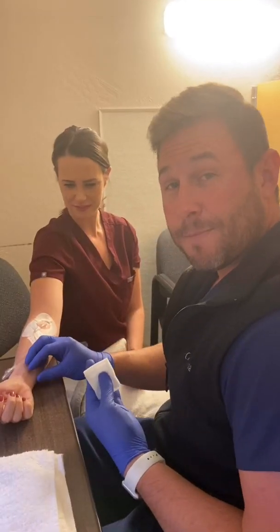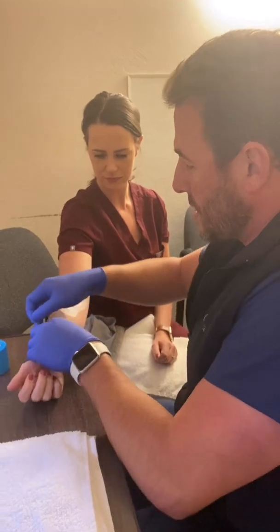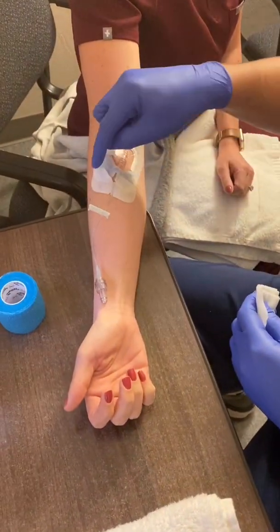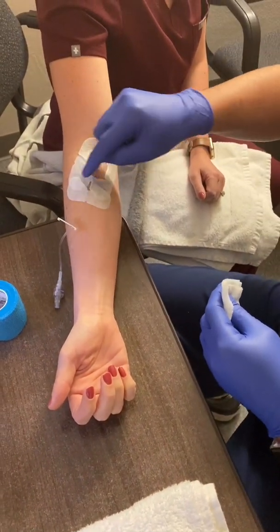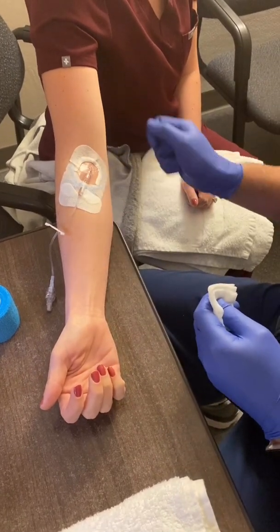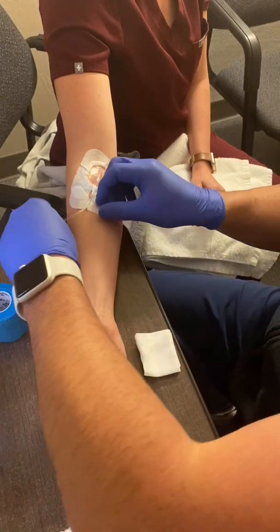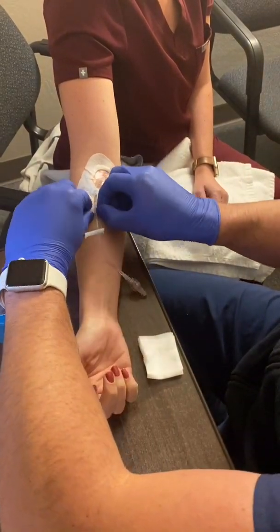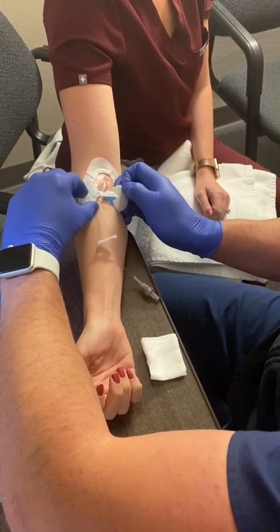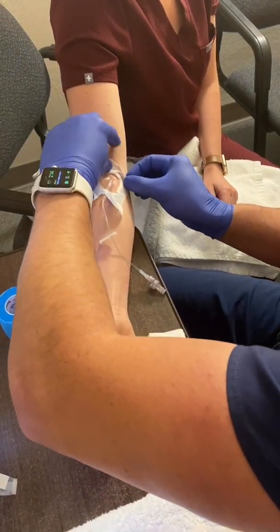All right, now for the second part, the removal of an IV. In a lot of places, you can actually put alcohol on the Tegaderm or the StatLock, and it will help remove the dressing. These right here are very nice dressings, so I don't have to worry about that. If you take right here, we pull it apart, just like that. And it'll come from the top.